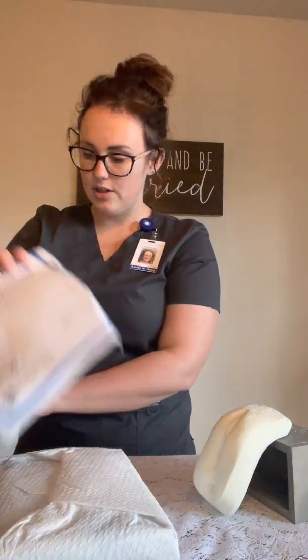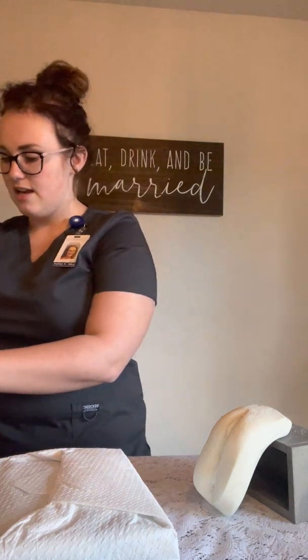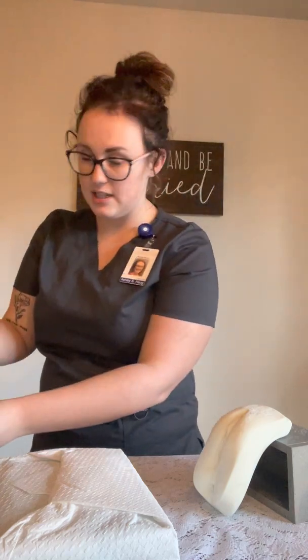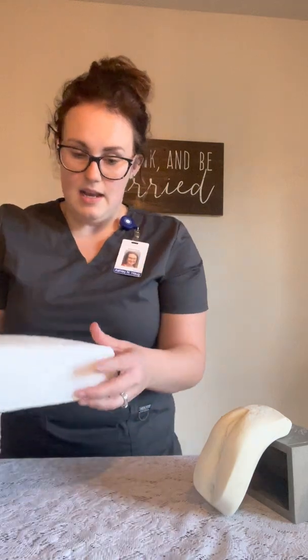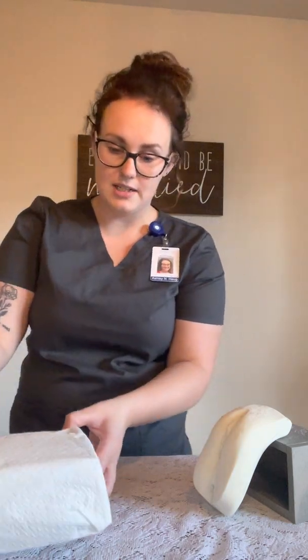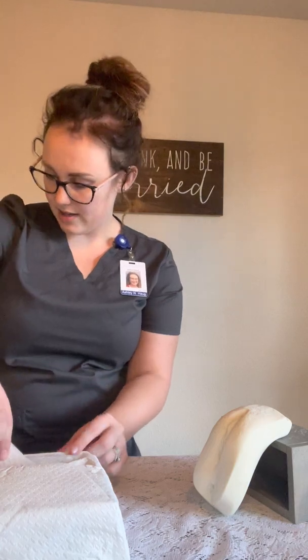And the outer piece, I'm going to keep over here so that I have a spot to throw my dirty items so that I don't contaminate the sterile field. So I have that right next to me. I'm also standing on the patient's right side because I am right-handed. And thankfully we have enough space in between the patient's legs that I'm going to be able to utilize this space to place the Foley catheter and the kit, so I have enough access.